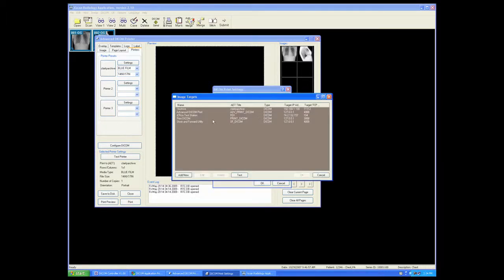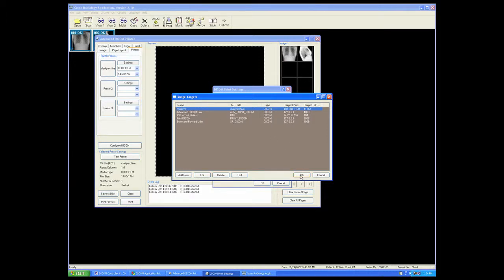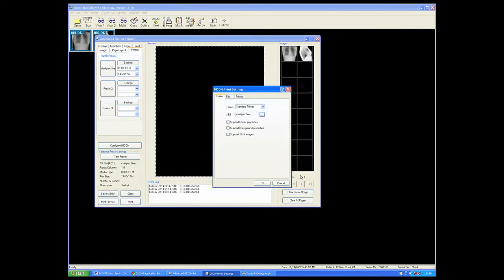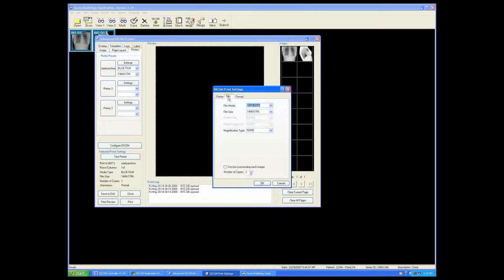Select the printer from the targets menu and select the type of film that is being used from the film tab.